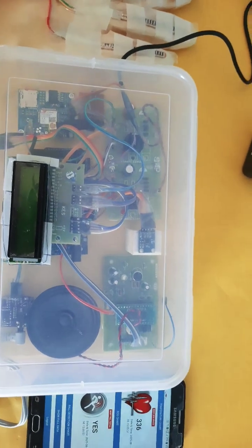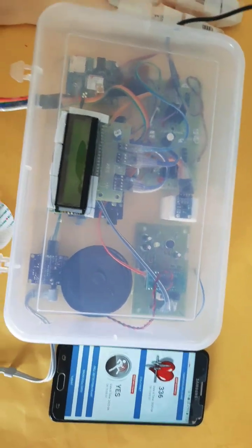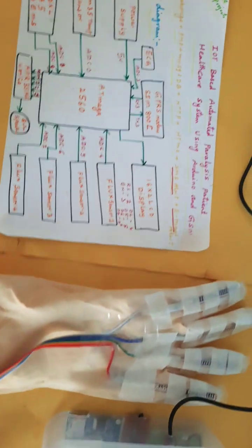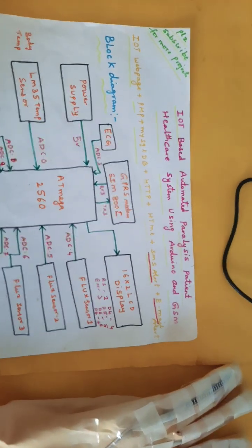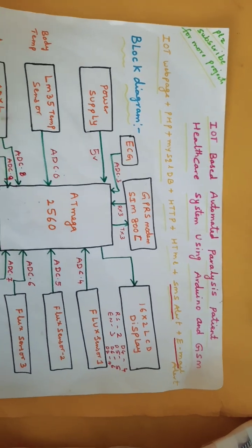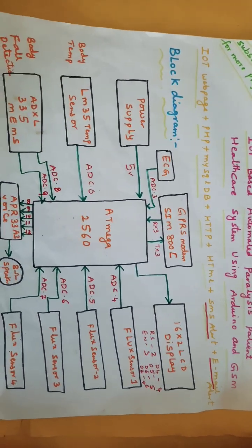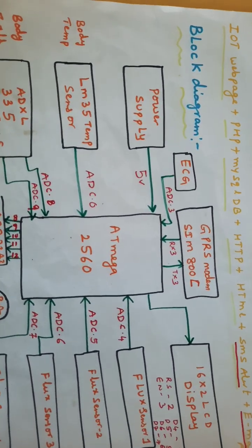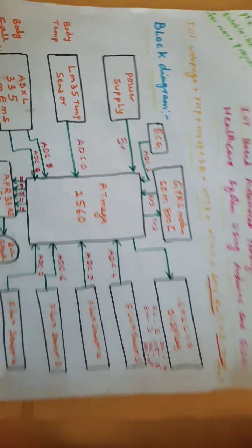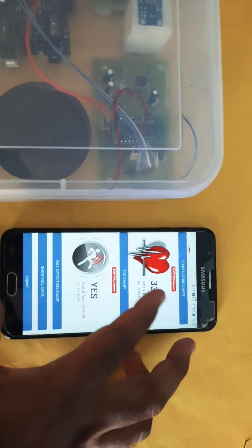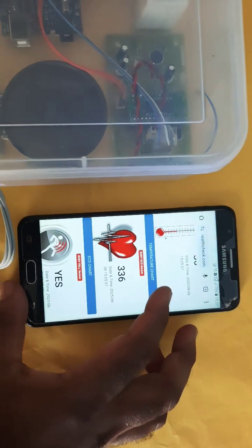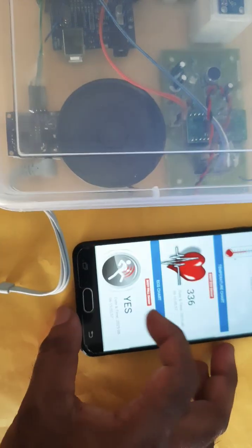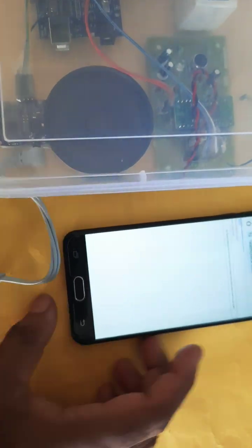Hi, we are from SVS Embedded. The project title is IoT Based Automated Paralysis Patient Healthcare Monitoring System. In this project we are using an IoT webpage showing temperature, ECG, and fault detection with temperature graph and ECG graph, along with date and time.